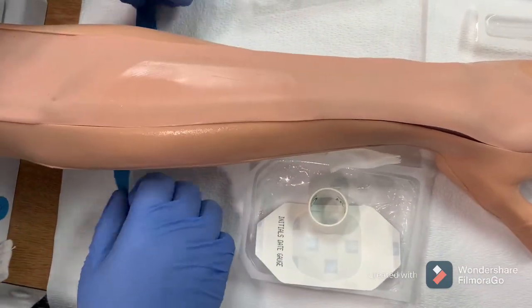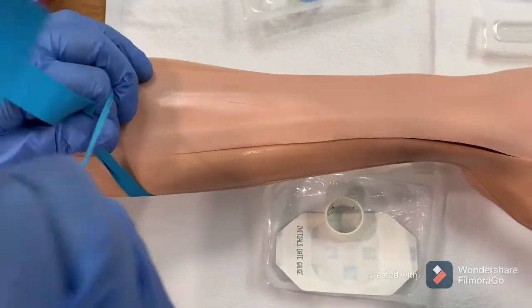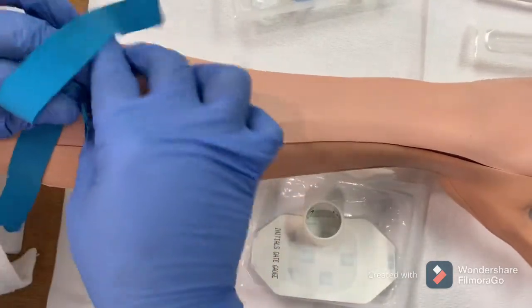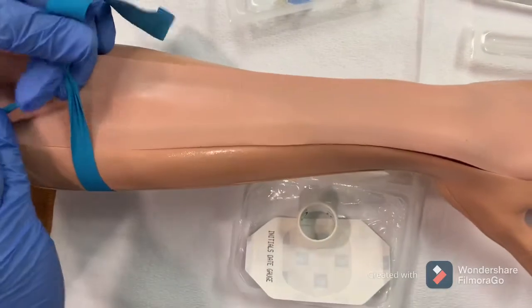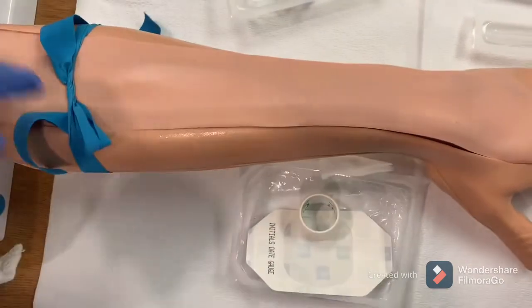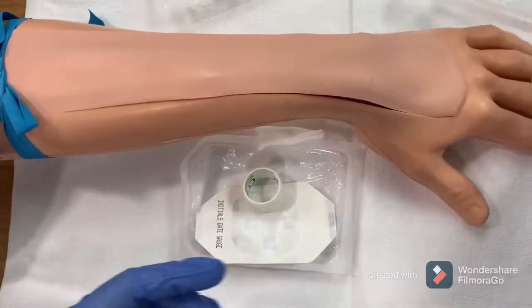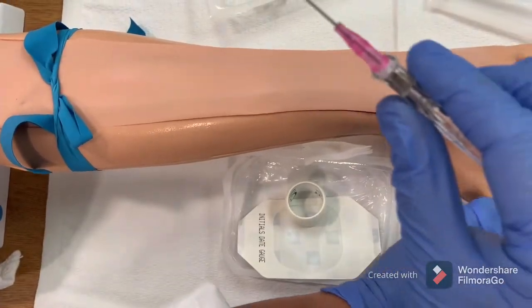Leave it open and let it dry. Reapply the tourniquet very tightly in order to occlude the blood flow to that area. Once you place the tourniquet, don't touch the area where you cleaned before.